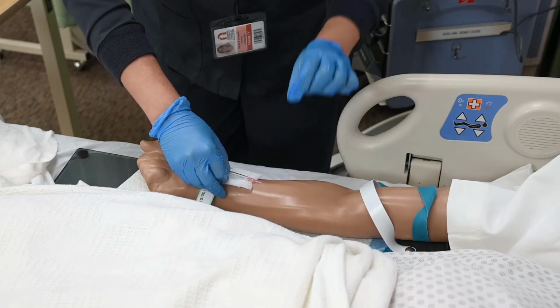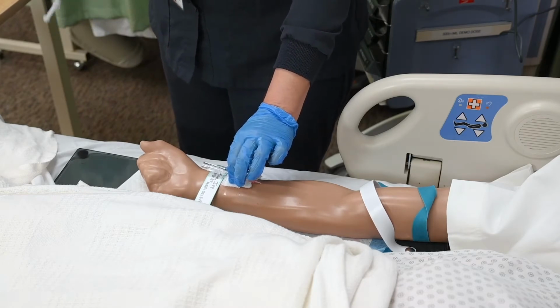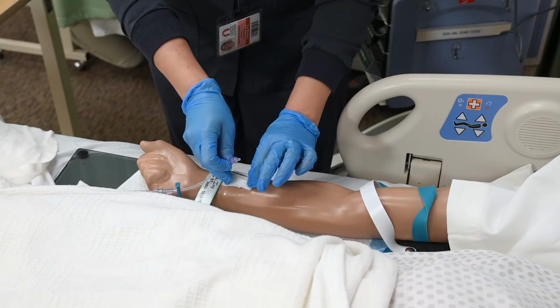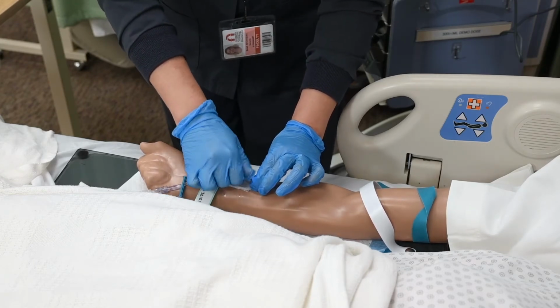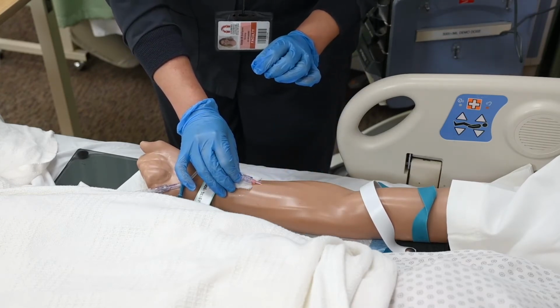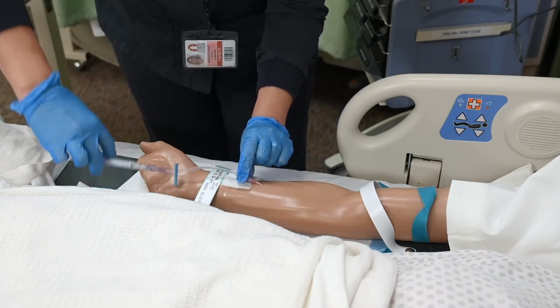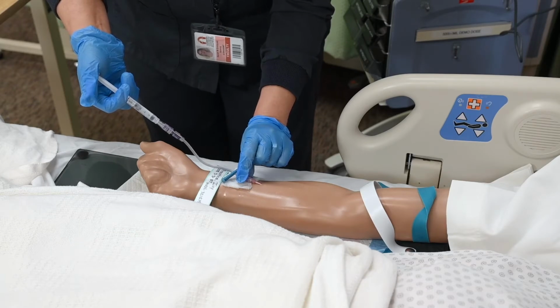Remove the cap from the extension set or INT. Disconnect the sheath from the catheter. Attach the extension tubing or INT set while maintaining sterility of connection. Do not let go of the catheter. Flush the catheter with 0.9% sodium chloride flush from attached syringe. Watch for infiltration.